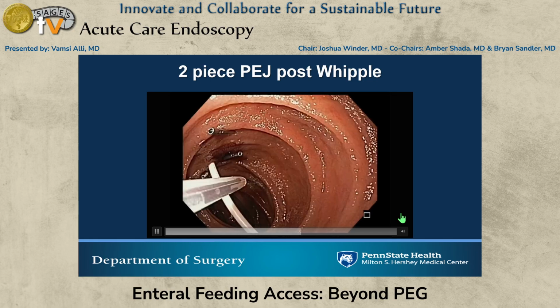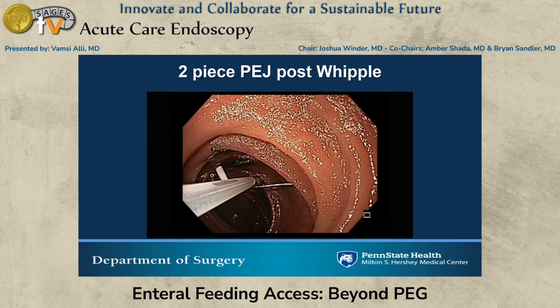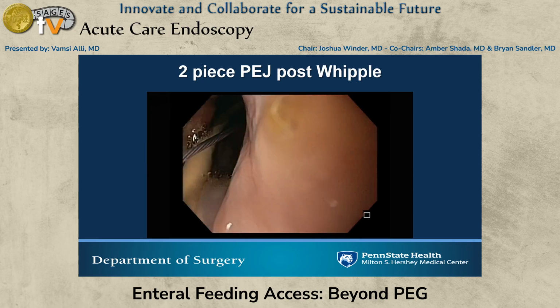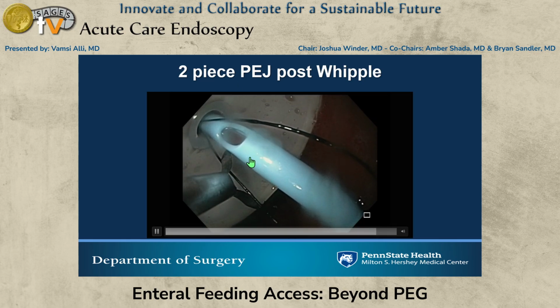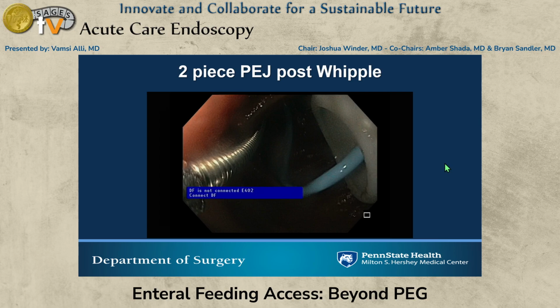The reason for this patient, where it wasn't just a straight jejunostomy tube being placed through this, was that she had medications that she was on, and my concern was that if I placed a straight J tube through there, she'd occlude. So we placed an extension through that. So this is the jejunal feeding extension through a PEG, although not in a gastric position. This is placed in the efferent limb of a loop GJ.